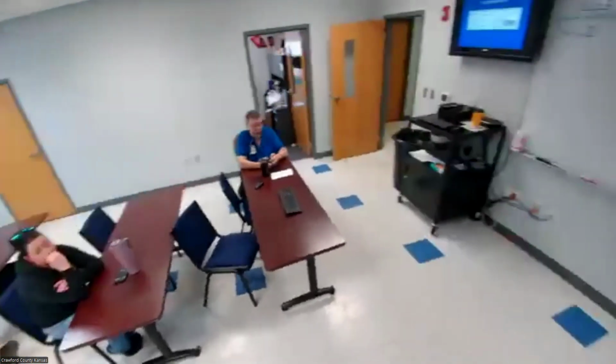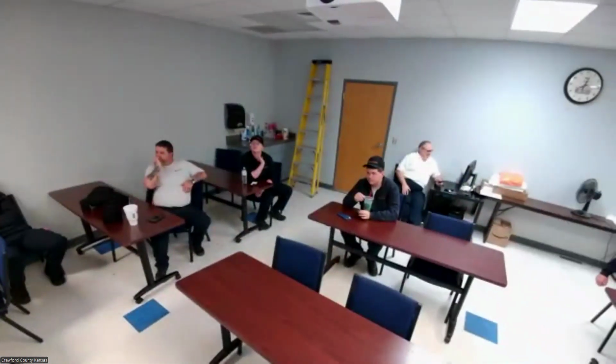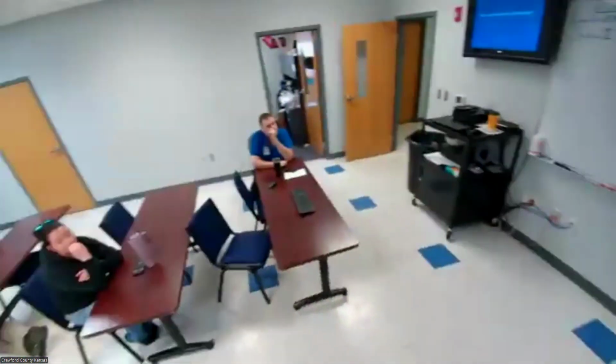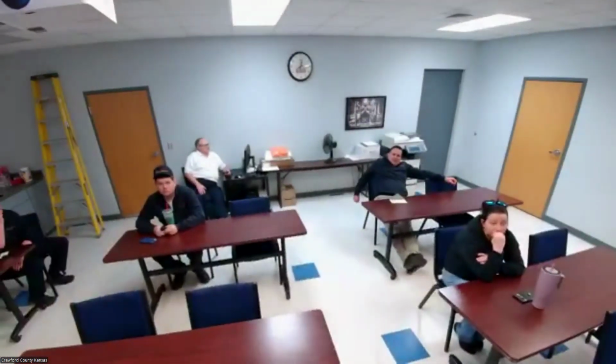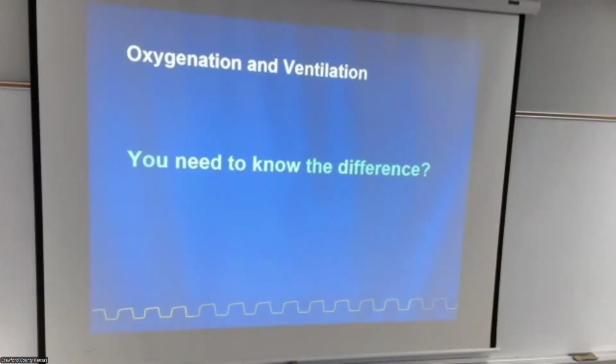Capnography does a lot of things for us, especially upon intubating the patient. It can tell us just how sick our patient is, whether our tube's in the right place or not, all by the waveform and the numbers we get. Big difference with capnography: we're going to understand the difference between oxygenation and ventilation. This is something that we do need to know.